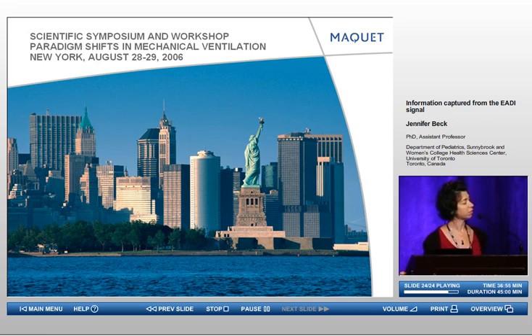How about obstructive apnea? We didn't measure the flow in these babies, so I can't tell you whether they were obstructive or not. But you can imagine that if they have an obstruction, the inspiratory effort that you can measure would be high because they're occluded. So when they make their inspiratory effort against an occlusion, if it's obstructive apnea, the drive would be high. So you can tell the difference between an obstructive or central apnea with this signal.